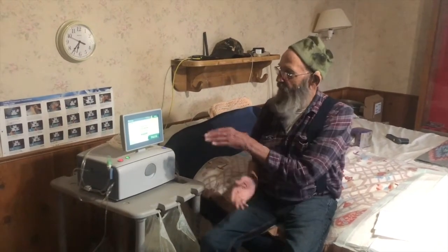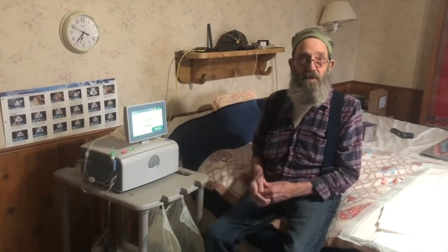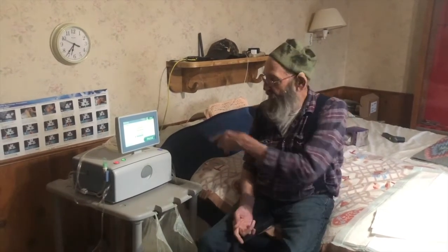The only thing is right now, this is that long wait period I tell you about. You got a 14-minute wait period here, and I usually let it get right down to 2 minutes left in the priming cycle, and then I pause that thing, and then everything in there starts doing what it's supposed to do. You know, it warms up that fluid, so when I get ready to hook up to that thing at 10 o'clock, boom, that stuff's 98 degrees. So I don't have that 40 or 50 cc's of really cool stuff going in there and then this warm stuff going in on top of it, you know.